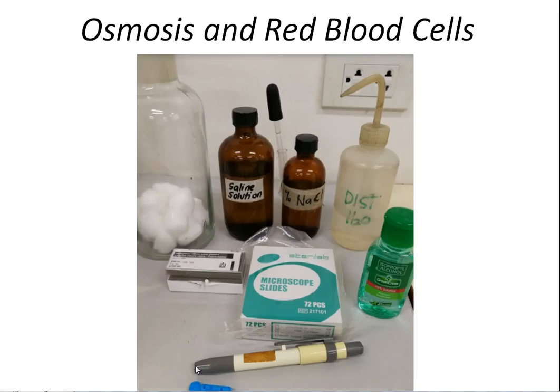We can choose either the middle finger or the ring finger of our subject, preferably the non-dominant hand, so that in case you still need them to sign some important papers later on, they can still do so. Now, we prepare the fingertip by wiping with alcohol cotton or an alcohol swab, and then you allow it to dry before we prick the finger.